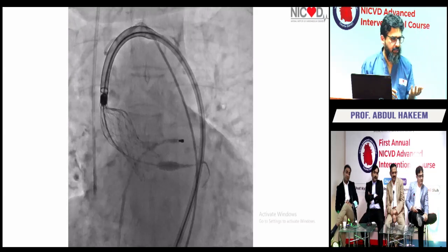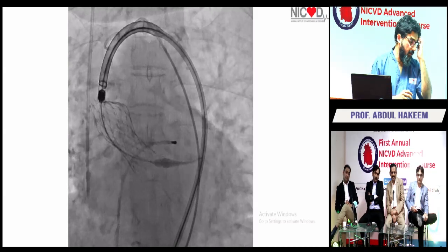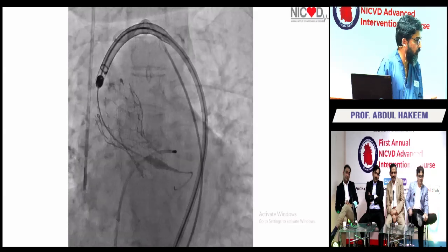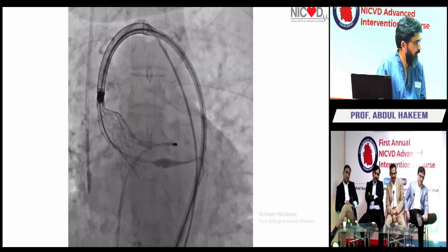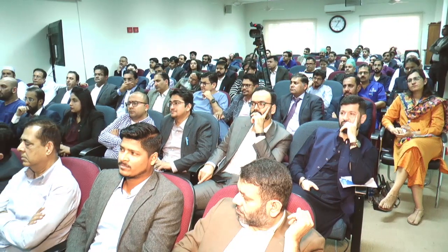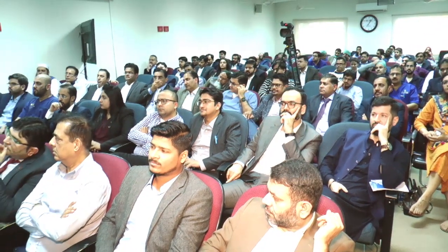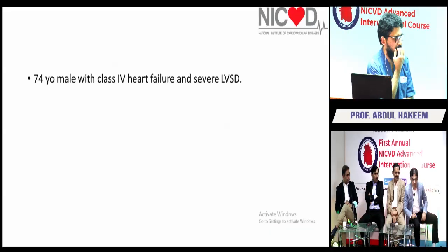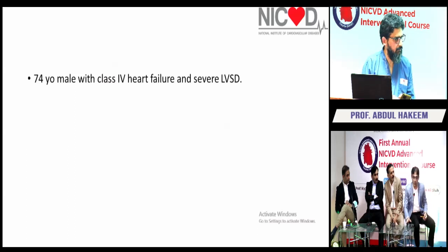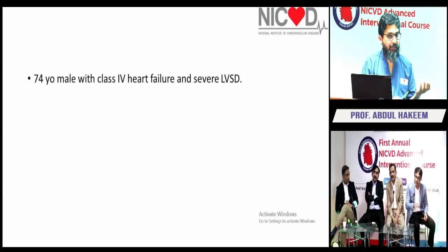Okay, so I think this patient did really well. Had trace PVL on follow-up echo 4 weeks later. She had no PVL, and her symptoms absolutely went away. You can add to that, when you have such a small LV cavity with so much of a gradient, do you think she will be at high risk of LV suicide? Is that the typical case you will see?